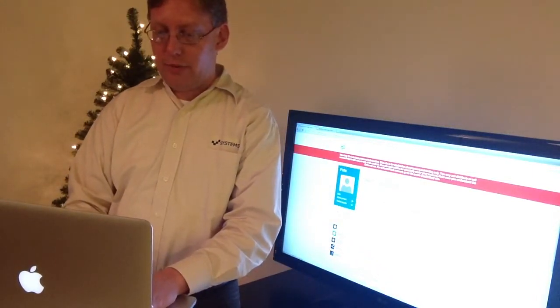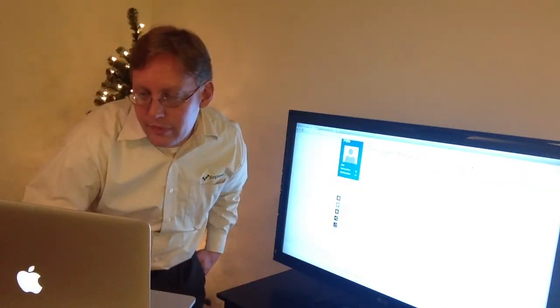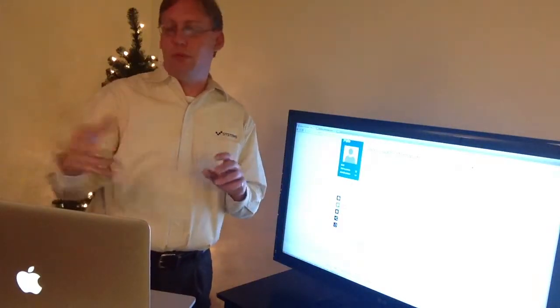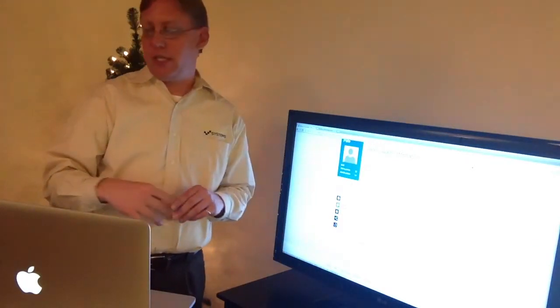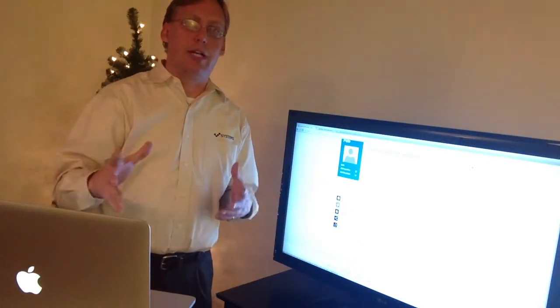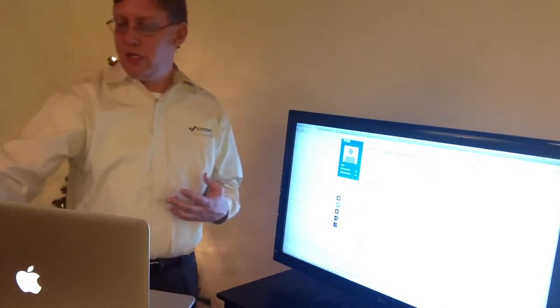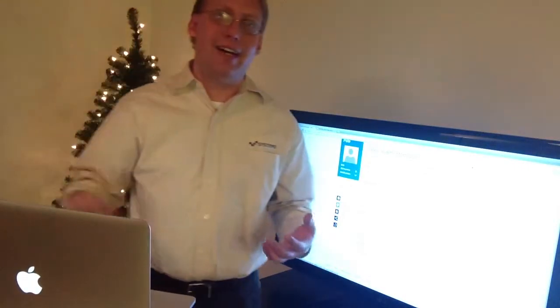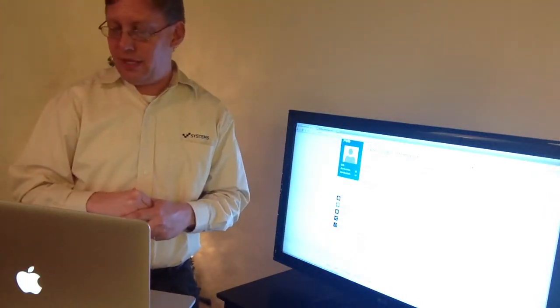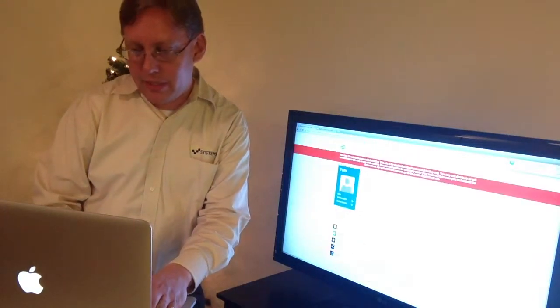And in the health information, I'm going to show you a couple samples in terms of the Braden skin assessment, where Microsoft HealthVault has two data types that were very relevant to this product: the health assessment, which is basically a risk assessment in our case, and a medical image study, which is typically a DICOM image, but in this case we're using it for the pressure ulcer image.